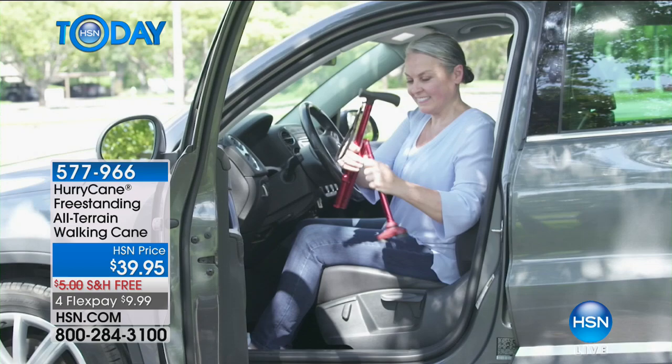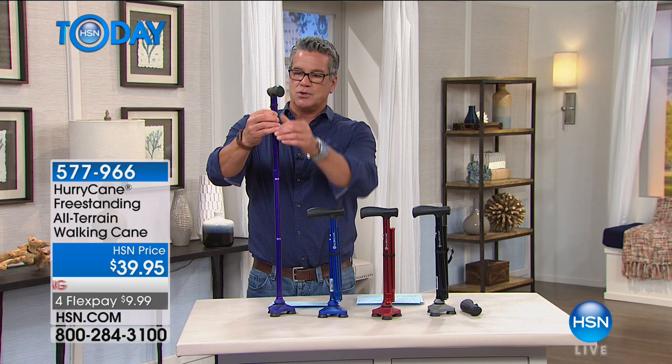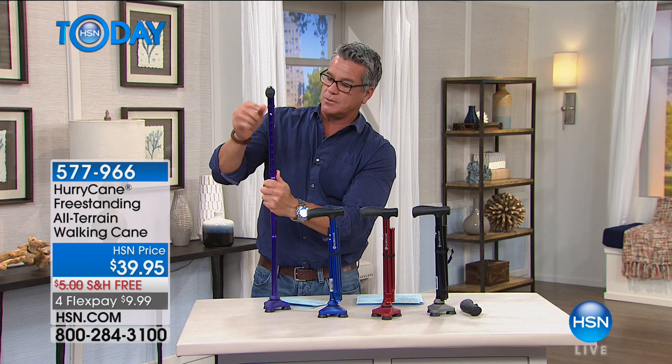There are eight different height adjustments built into this as well. If you come up under the handle, you'll see there's a little depressed knob right there where you can adjust this up or down. Push it down and then lift it, and this will go up or down. Depending on how tall you are, you can see these are the levels of adjustment.